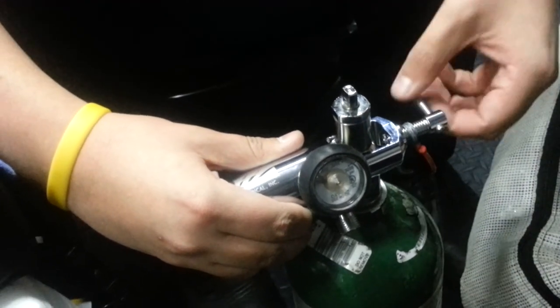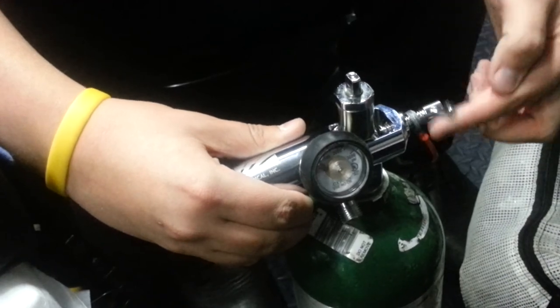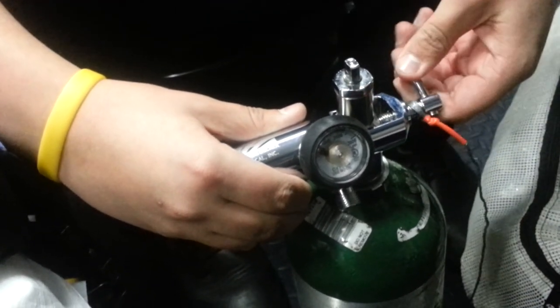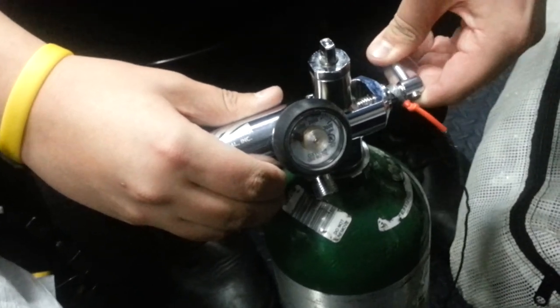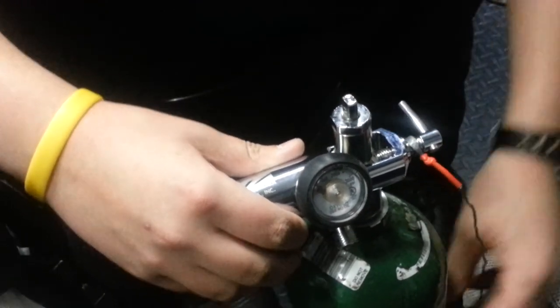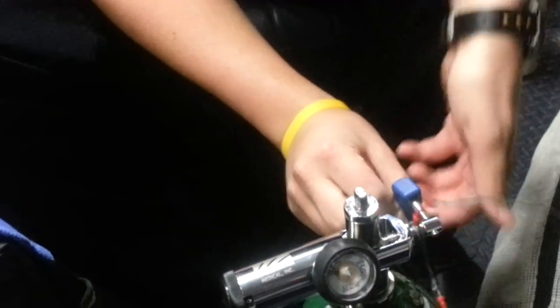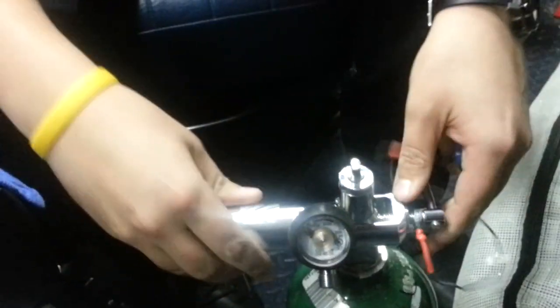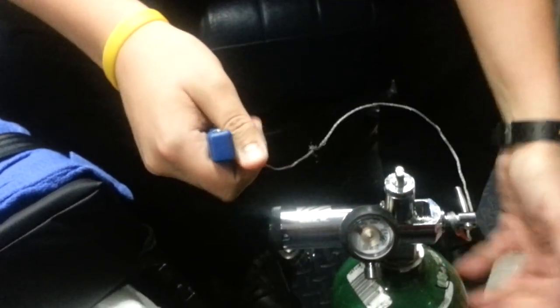Then you're going to tighten the O2 regulator so that it's nice and snug with the O2 tank. Sometimes these are really short and you can't get much leverage, so you can use the wrench to get more leverage and more rotation so it's tighter. Then make sure it's on tight and there's no leaks between the actual tank and the regulator.